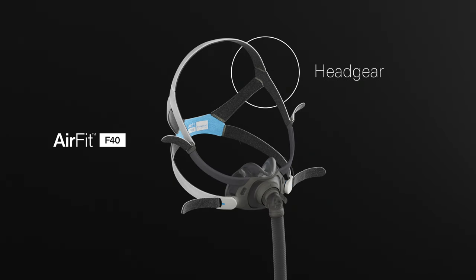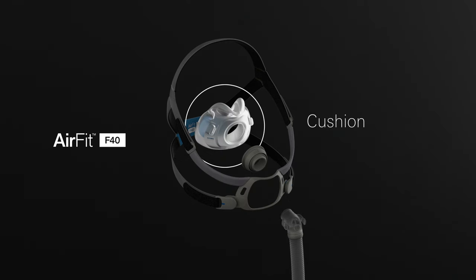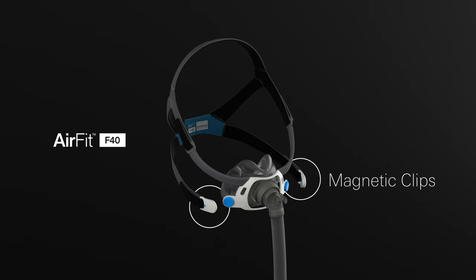This is the headgear. Frame. Cushion. Removable vent ring. Elbow and short tube. And magnetic clips.